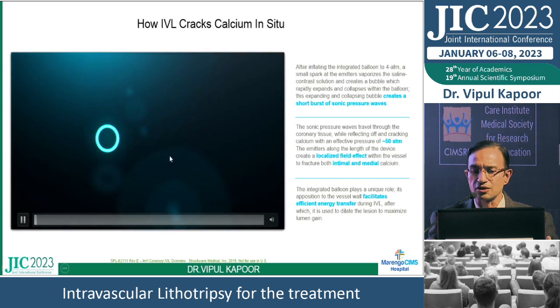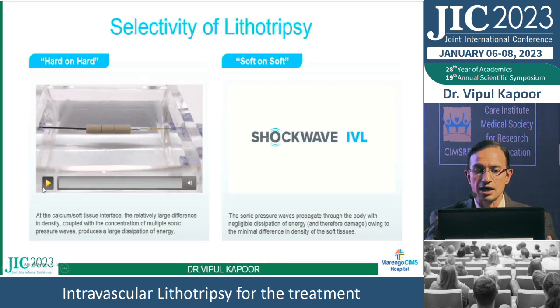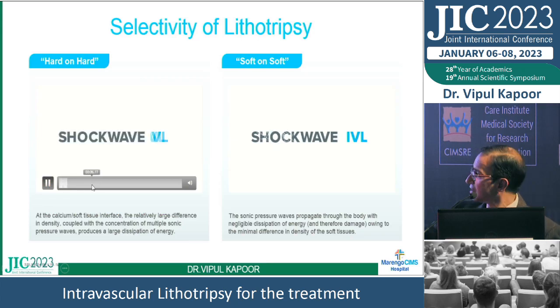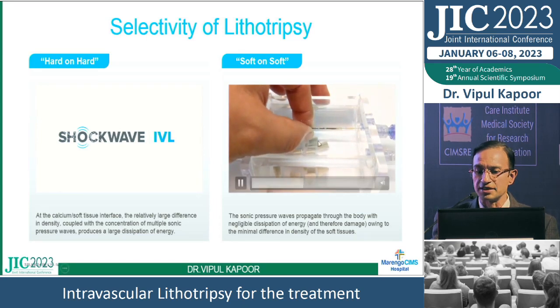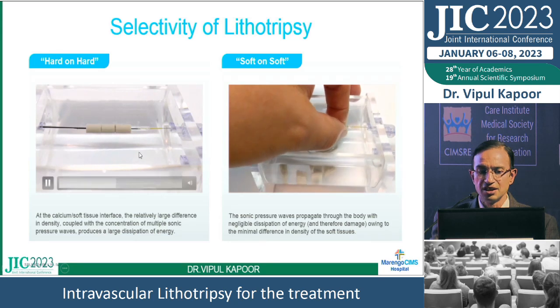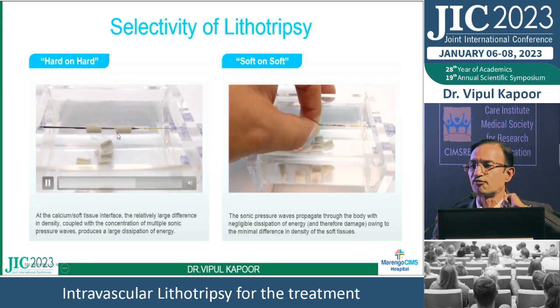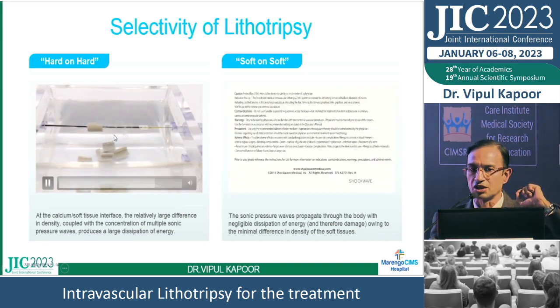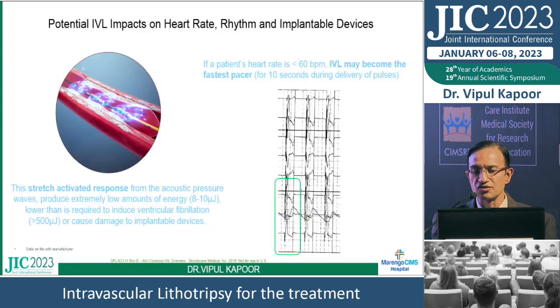So it's a short burst of sonic waves. So it is hard on hard. Just look at how it works. So in this video you can see that there is a structure which just looks like calcium here. This is your hand. See, it is not injuring this. It is just a small shock like this. But if you look here, you can see it is breaking the calcium, and this calcium just pulls apart. So this is the difference. This is the beauty of the technology, that it doesn't injure non-calcific tissue, right? And that is why it is so safe.